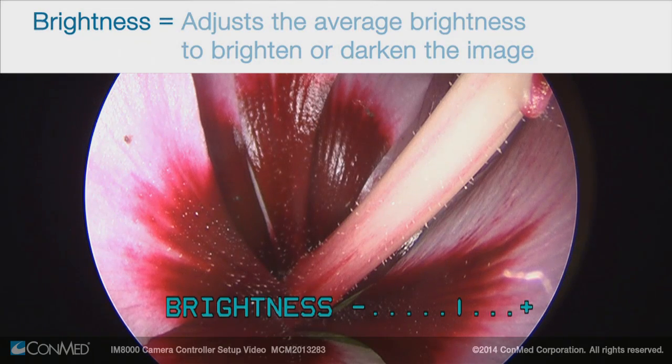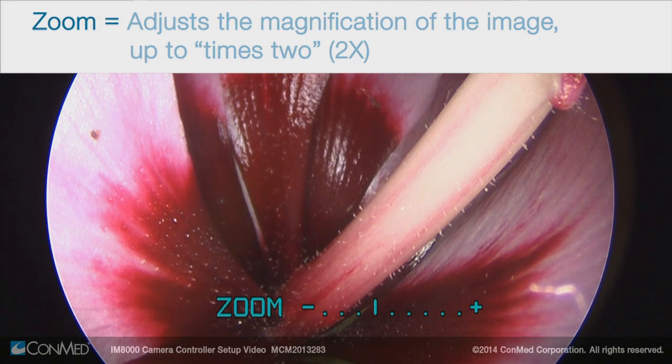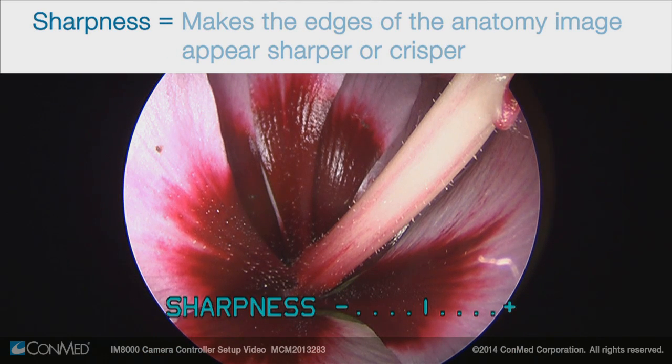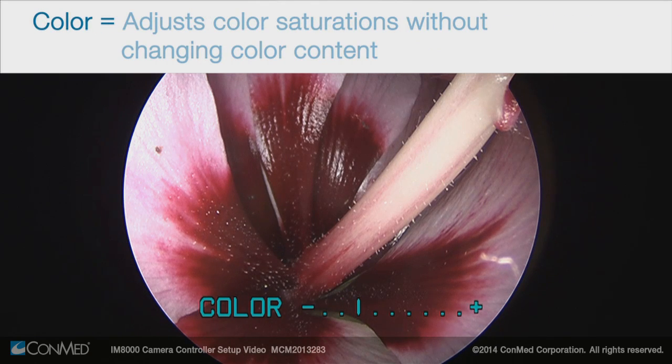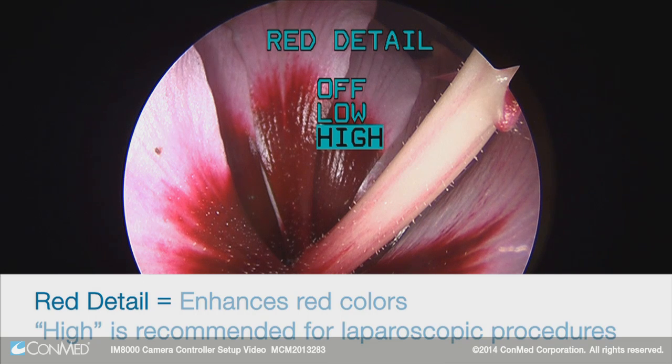The brightness function increases or decreases the average brightness to brighten or darken the image. The zoom function increases or decreases the magnification of the image up to times two. The sharpness function makes the edges of the anatomy image appear softer or crisper. Color will increase or decrease the color saturation without changing color content. Red detail enhances the red colors and the many shades of red; the high setting is especially useful for laparoscopic procedures to show organs in a truer red color.